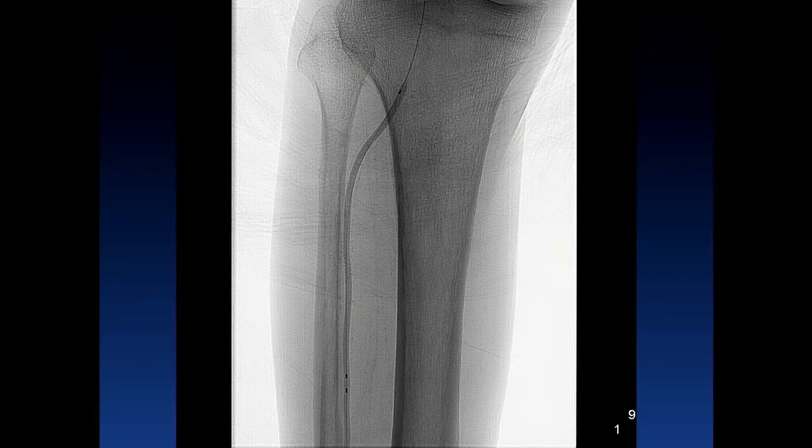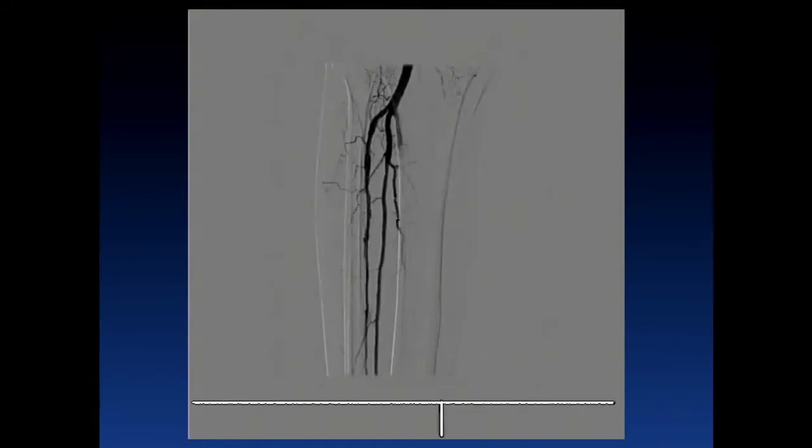But the balloon actually expanded pretty easily. I expanded this at 6 atmospheres for about 3 minutes to do a long segment, prolonged balloon angioplasty, and was anticipating that this should result in a pretty good result, hopefully with minimal recoil and no significant flow limiting dissection. So this is the angiogram right after I did that. On DSA, you can see coming down, there's some good flow in the peroneal.